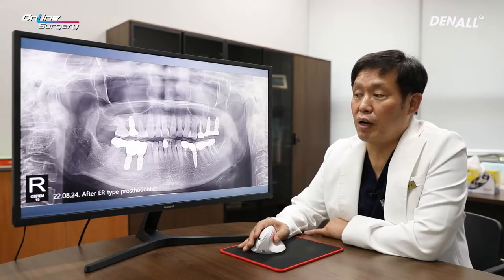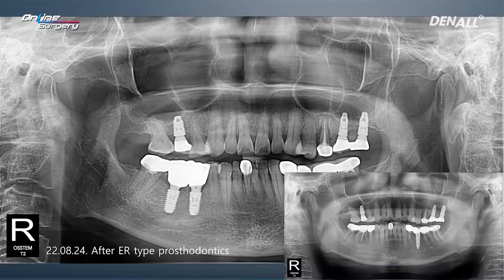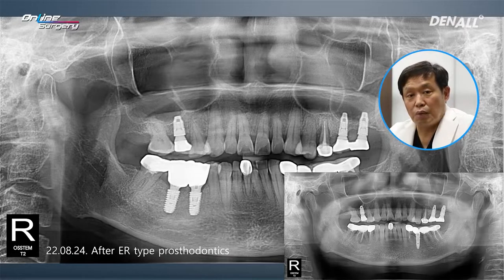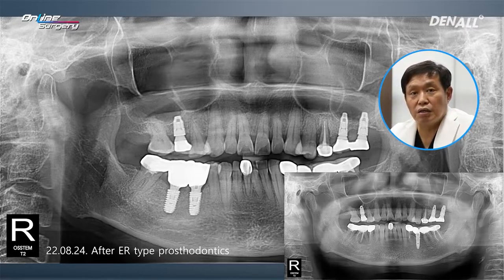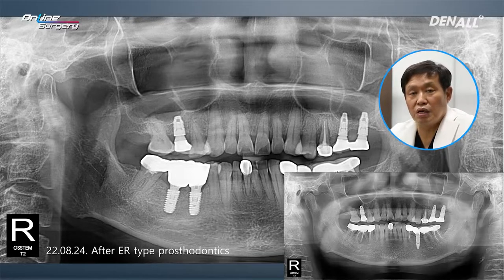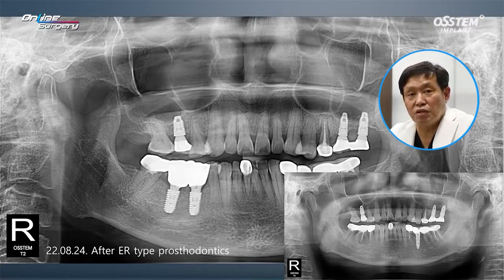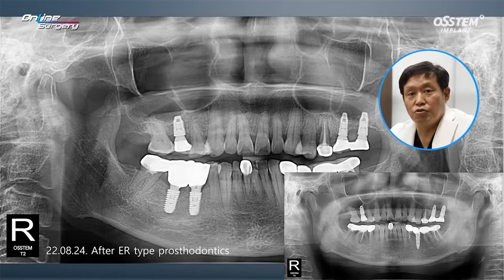Prostheses were planned in the pre-op image for numbers 45 and 46. Because there was a periapical lesion, the buccal wall was entirely destroyed as shown on CT. AOS collagen — the new collagenated bone from Ostem — was used for socket preservation in the area where the buccal wall was lost. After 4 months, implants with BA surface were placed. After 2 months, ISQ values were favorable, impression was taken, and prostheses were delivered.